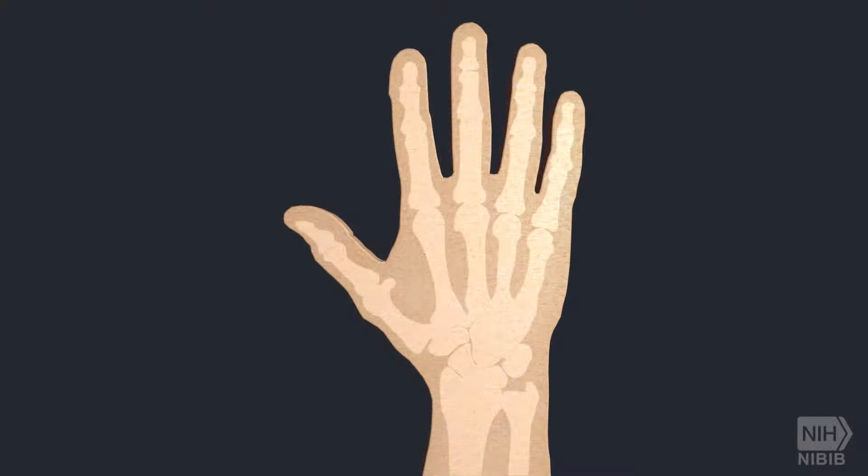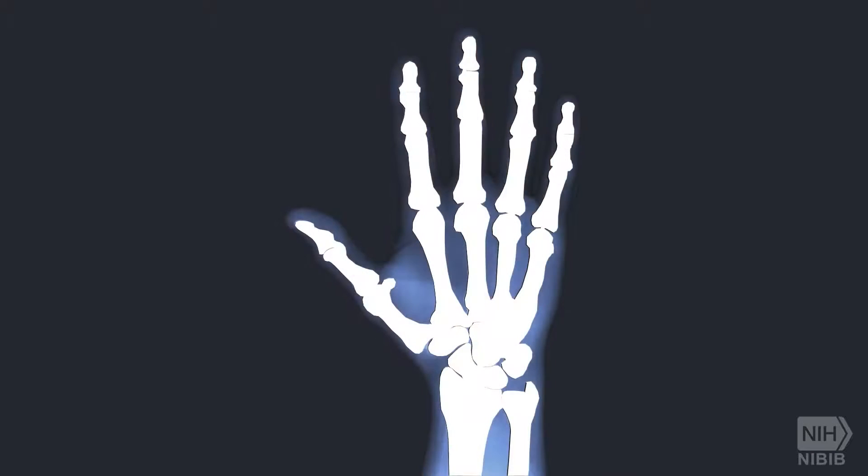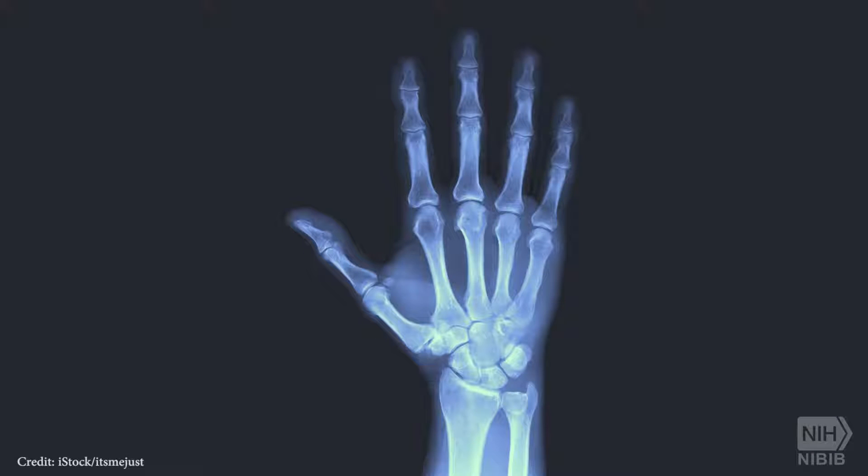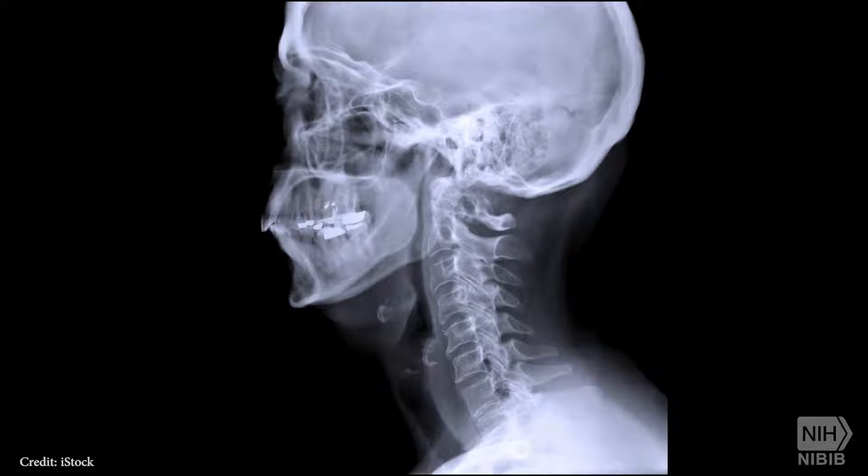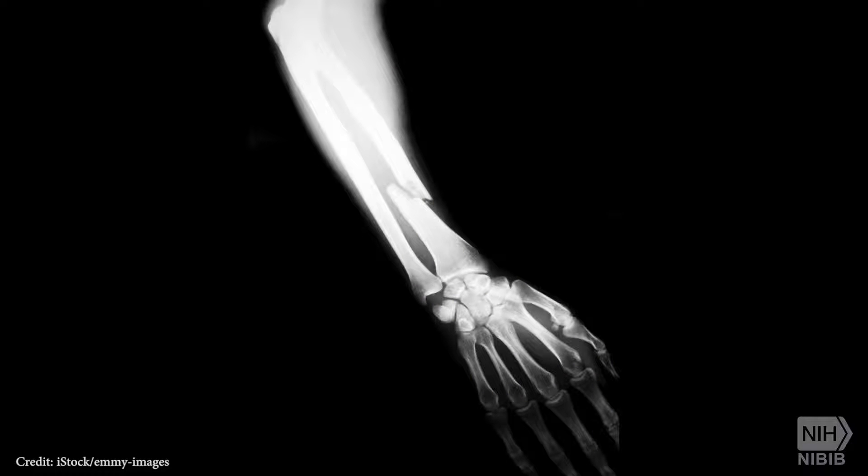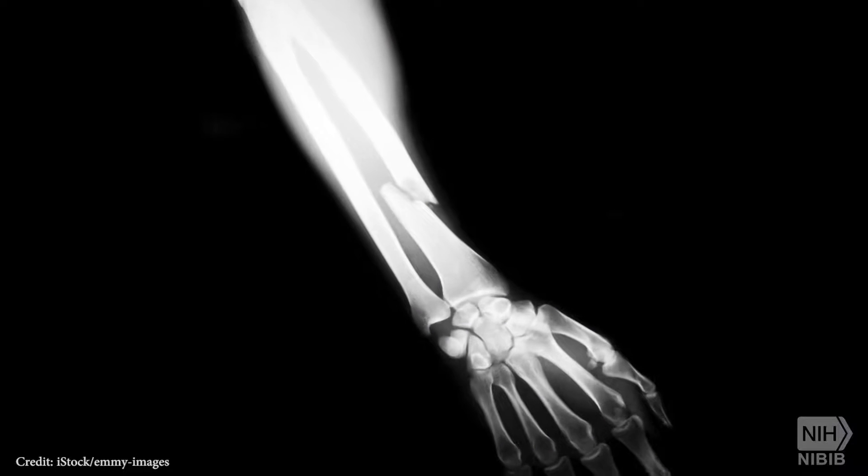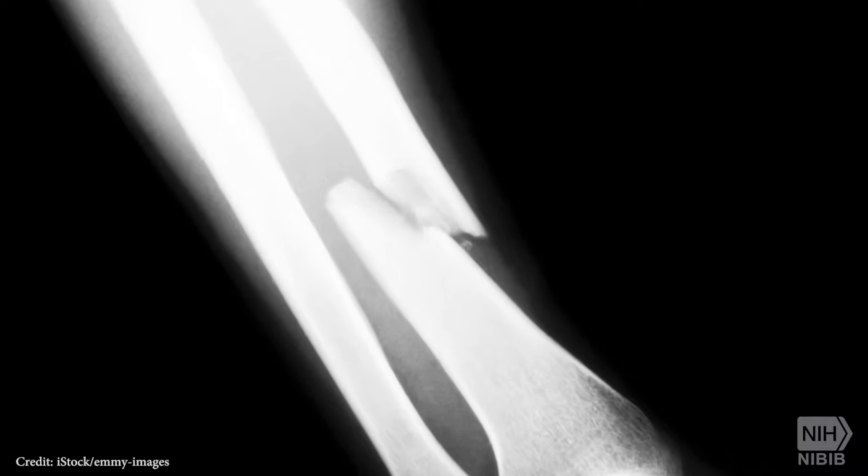x-rays directed at the body produce shadows on the opposite side that can be registered on film or on a digital sensor, so that bones are clearly visible while soft tissues, such as muscle, are shadowy. As a result, the two-dimensional images formed by the x-rays are quite useful in revealing structures within the body, and can easily display fractures in bones.